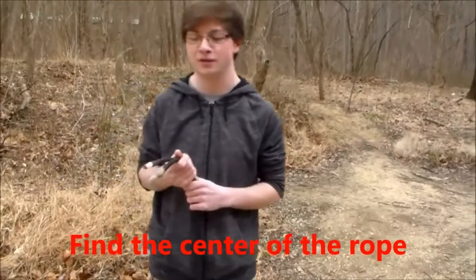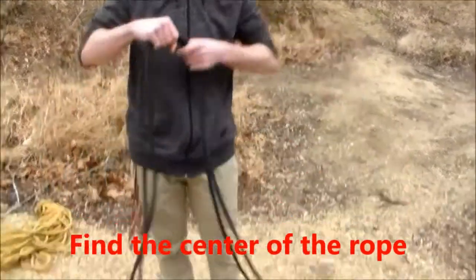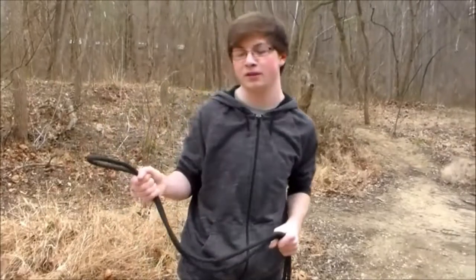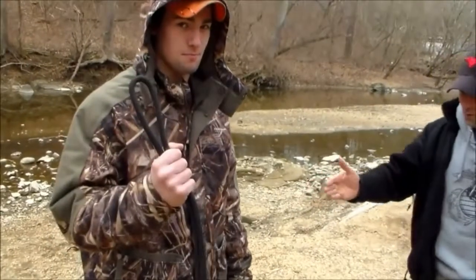The first thing you want to do is find the center of the rope. To do this, take the two ends of the rope and walk them out until you reach the middle. Once you've found the center of the rope, we're going to begin the construction of the stretcher.